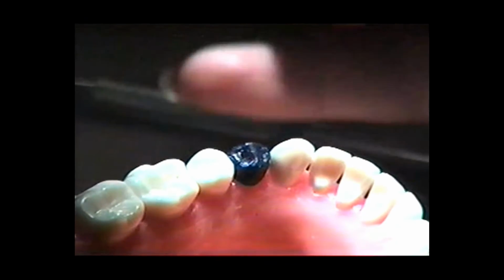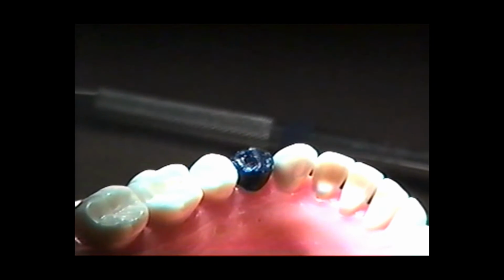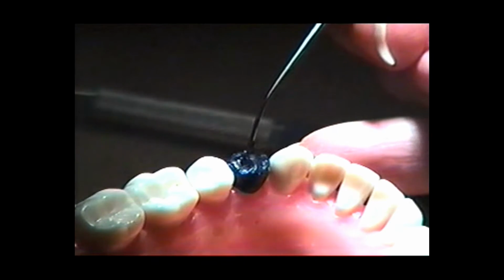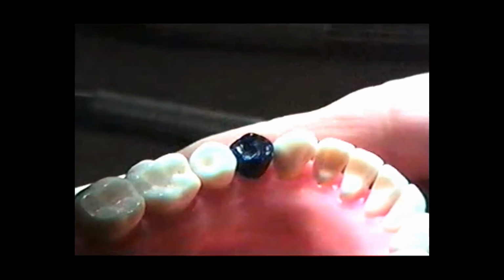The other thing that I was just noticing is that the cusp tip is low on the buccal, and I'm not occluding where I want to on the maxillary, so at this point I'll add just a little bit there too. And I'm just going to add right in one spot for now, and then pull it and close it together.